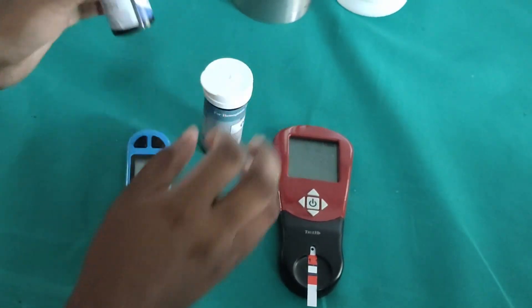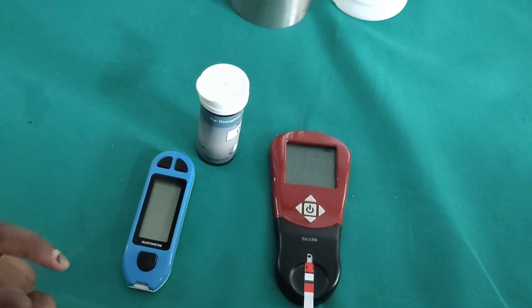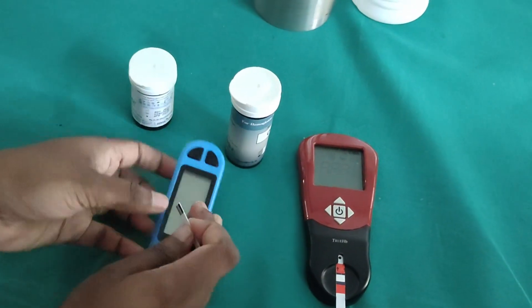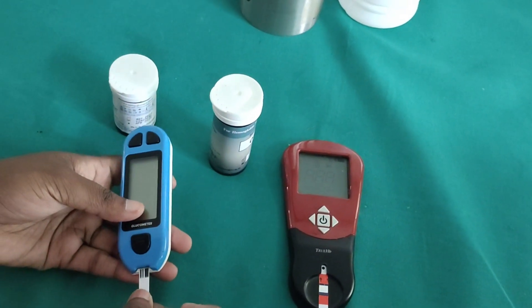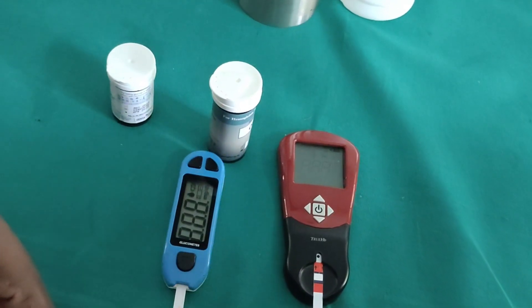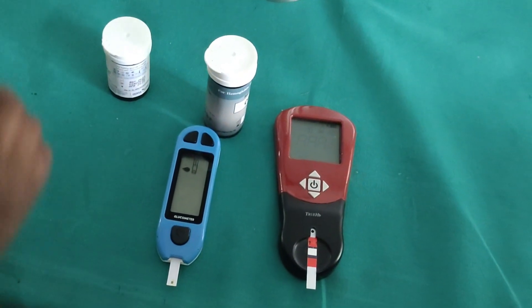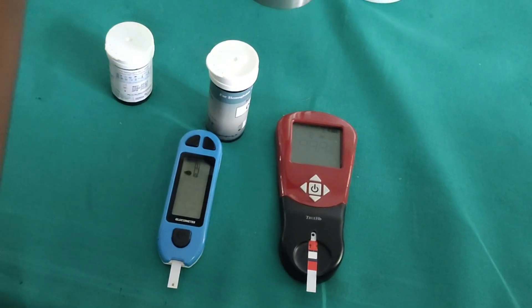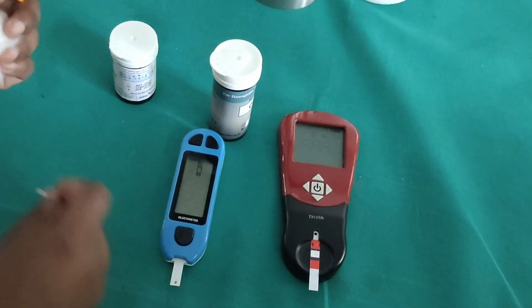The patient came with generalized weakness, so I am going to check him for RBS as well. We have to insert the RBS strip too, and we are going to need a lancet and some cotton.